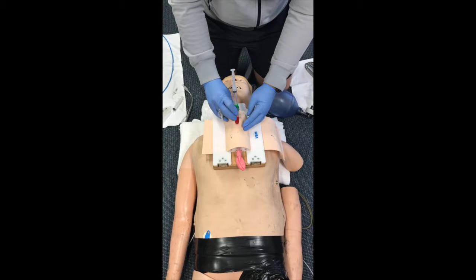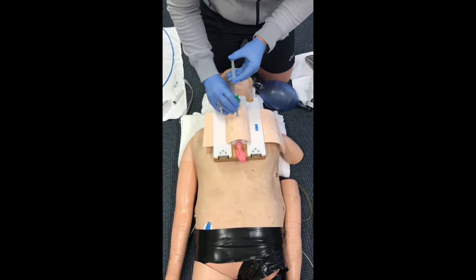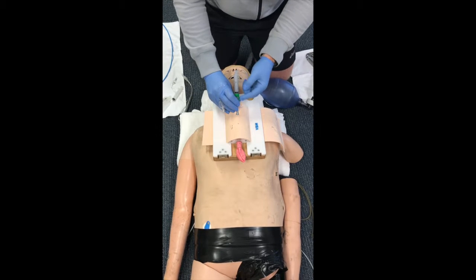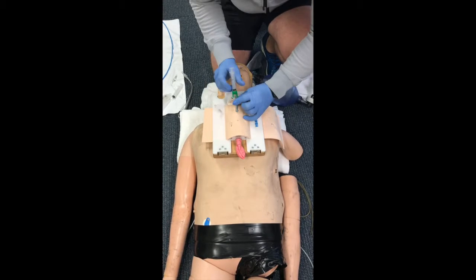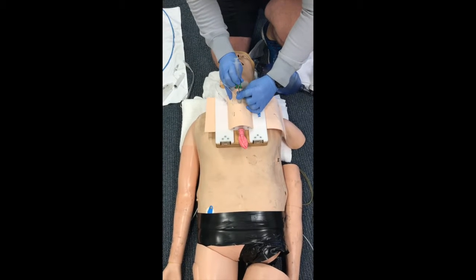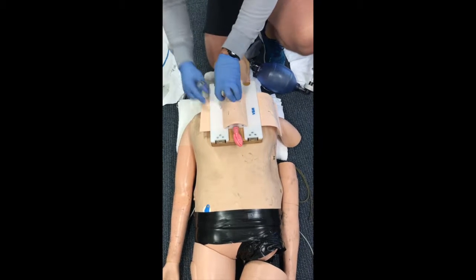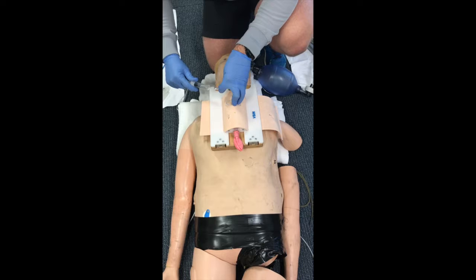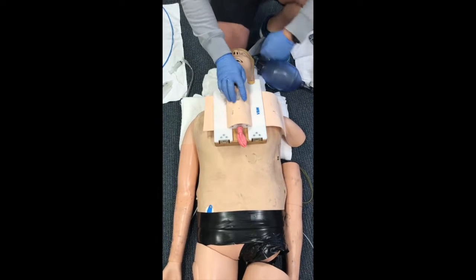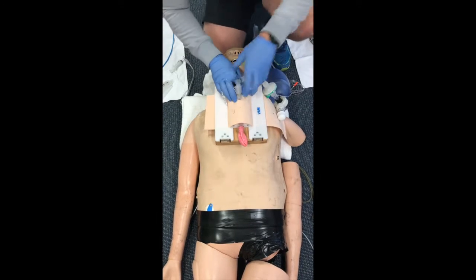From here, I go 60 degrees, and I remove the red stopper, and I push on the cannula until I hear a click, and I know that the green mechanism here is clicked. From here, I'm able to advance till it's flush with skin, removing the sharp. Pull up my cuff. And attach my BVM.